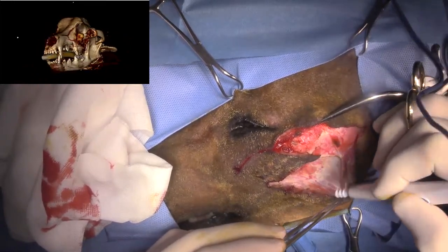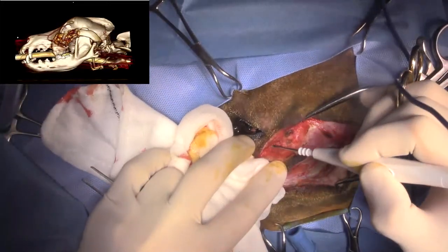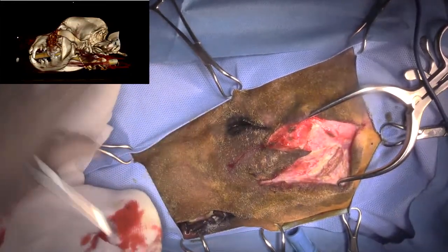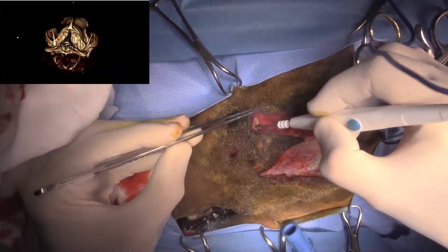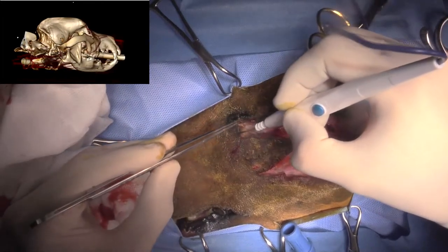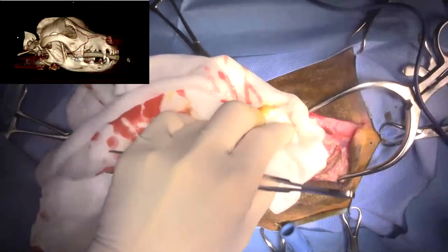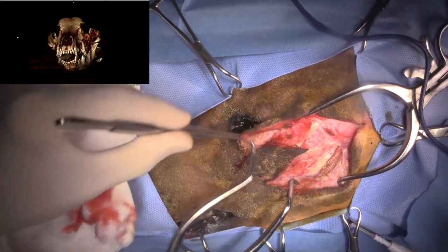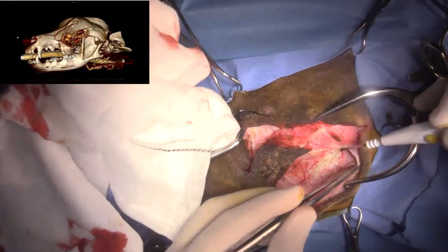Be a bit of a puzzle getting into these guys, especially on the medial orbit. It can be tricky to figure out what to do and where to cut because there are several different planes of bone. It's making some of the muscle in the face twitch a bit. Get a bigger gap in here and try to open things up a little bit. I'm just taking things slowly.